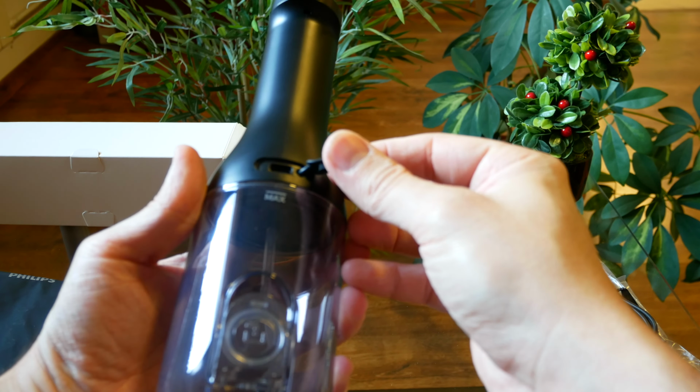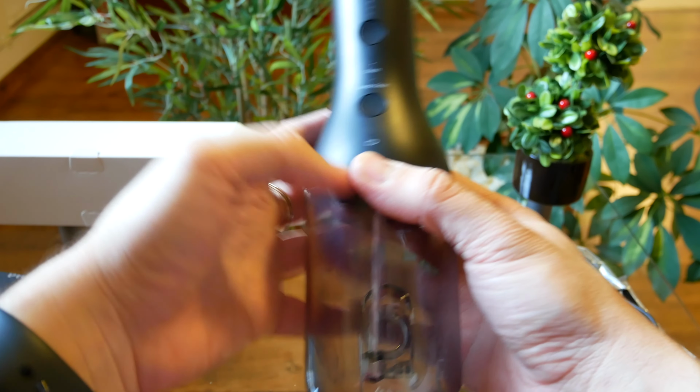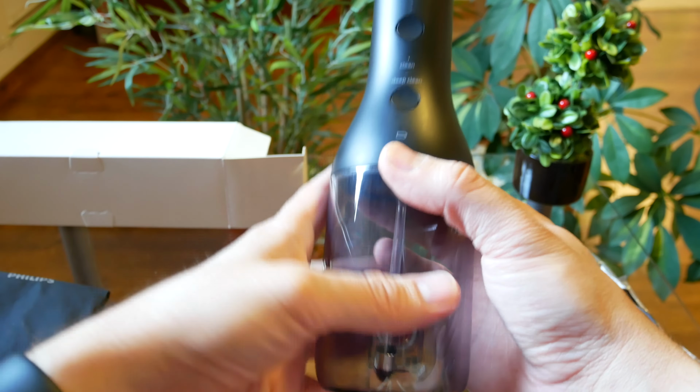And it has a power button, what seems to be an intensity tweaking button, and two cleaning modes, clean and deep clean. Okay, yep, there is level 1, level 2 and level 3. The adjustments of the nozzle pressure, the fluid pressure, and you can select clean or deep clean, each one with 3 levels of intensity.